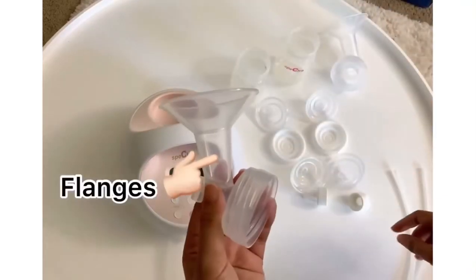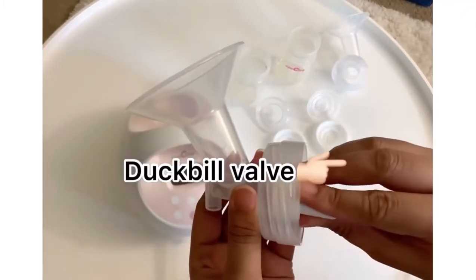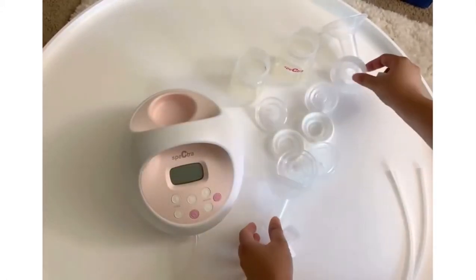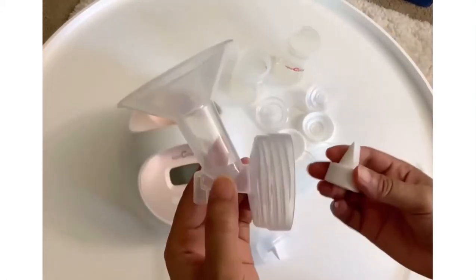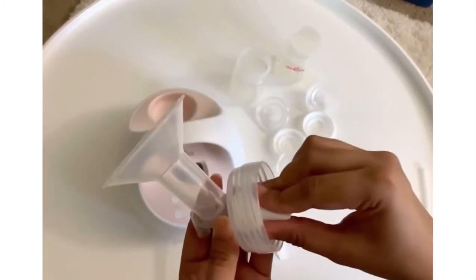Next is your flanges. We're going to get the duckbill and securely connect the duckbill into the flanges. Do it with the other one if you're using double pumping.